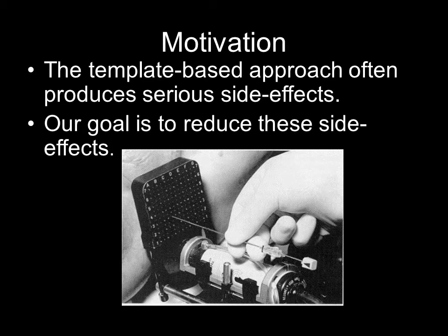However, the template restricts the number of possible insertion locations and directions. This often results in puncture of obstructions like penile bulb, urethra, and urinary bladder. This results in side effects like trauma, edema, incontinence, and impotence. Recently, a template-free freehand approach was developed by Dr. Joe Shu. However, this approach requires a high degree of skill acquired over years of experience, and using a template is still the standard approach in clinic.